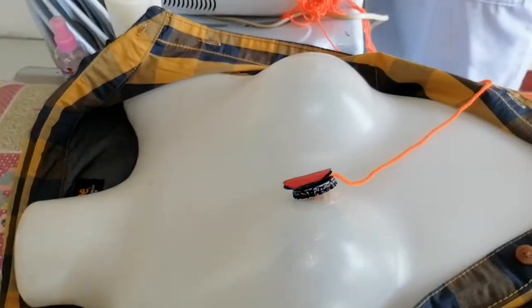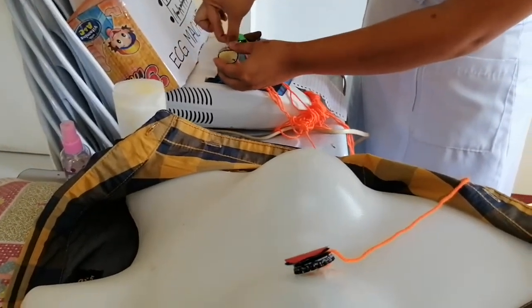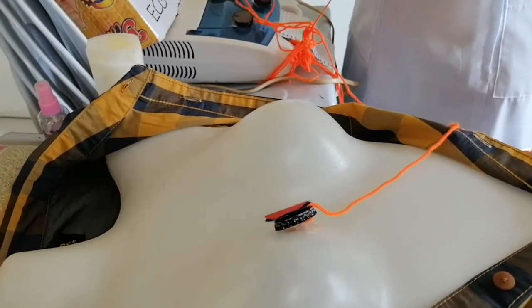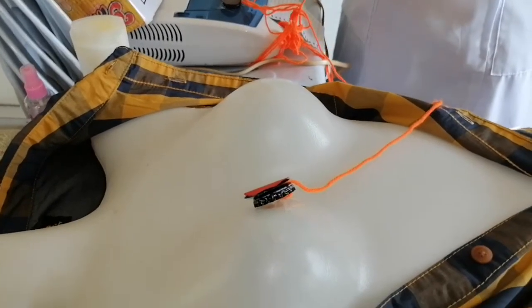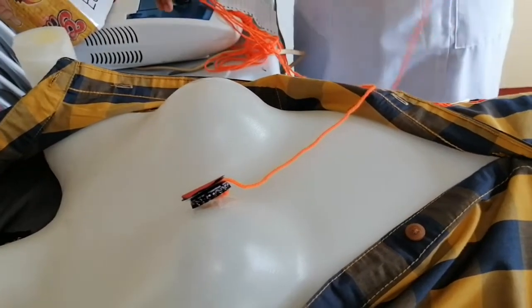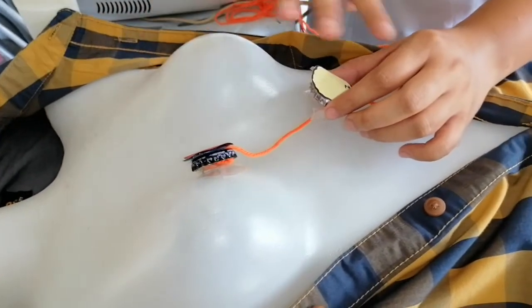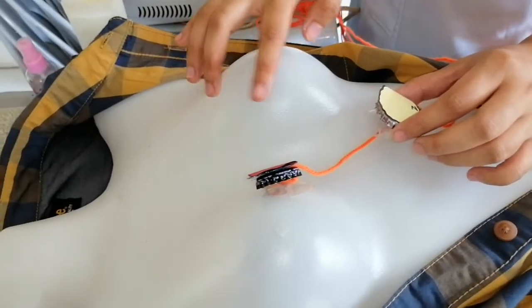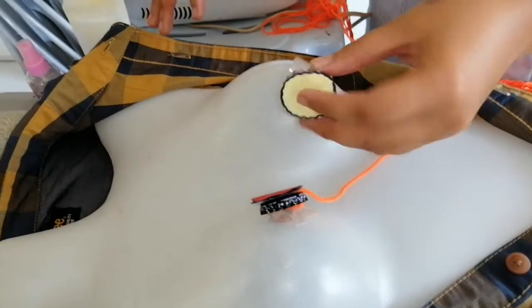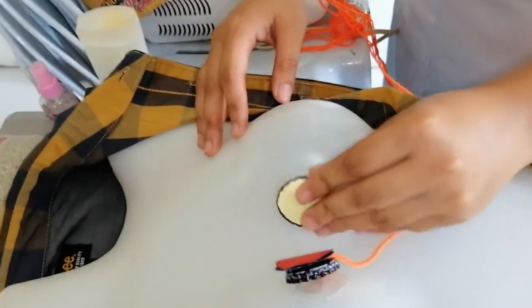The next to be placed is the V2. Actually, the V1 helps to view the septum of the heart. And the V2 also helps to view the septum of the heart. So we're going to place the V2 on the opposite side of the V1. It is also located at the fourth intercostal space, on the left sternal border. So just place it opposite the V1. Here is the V1.